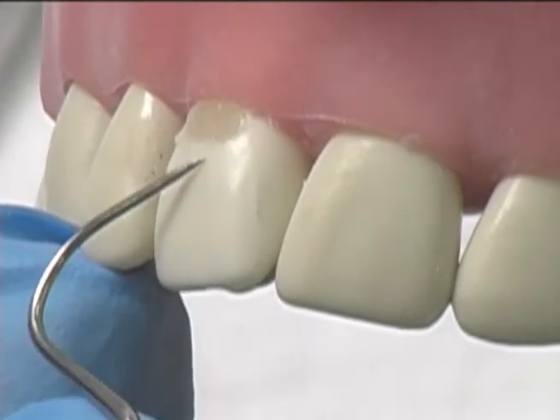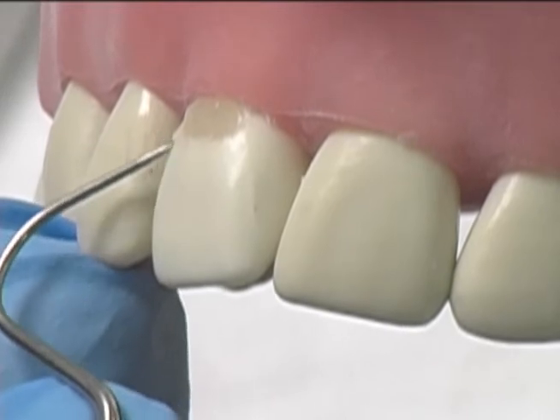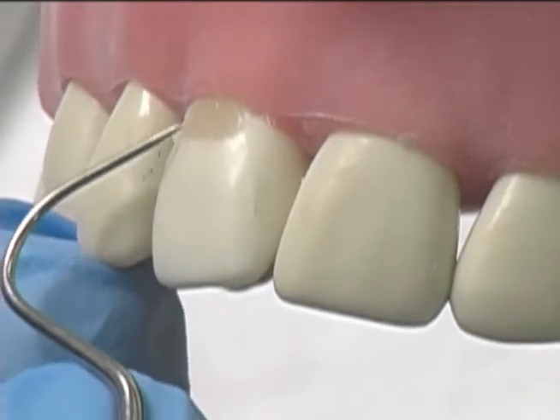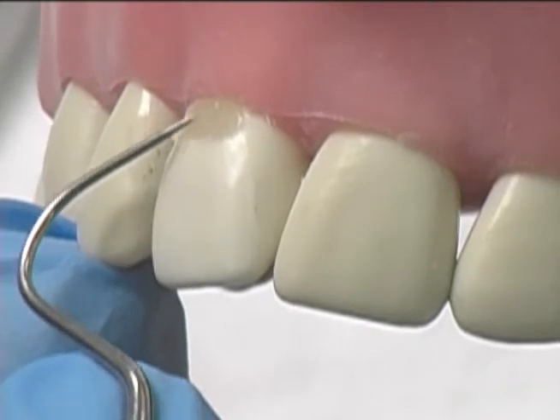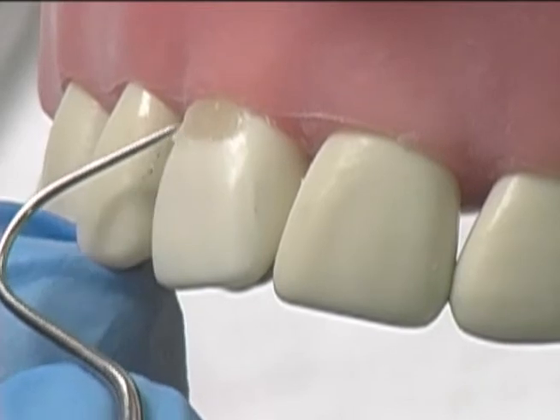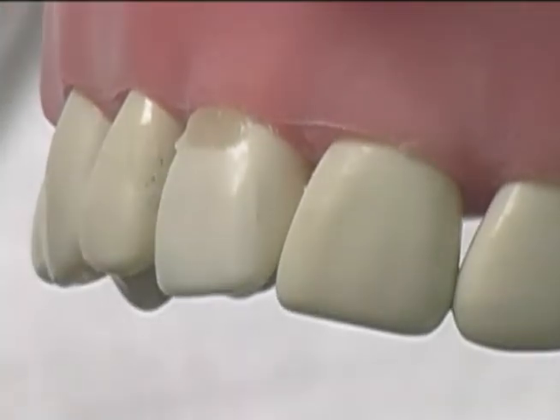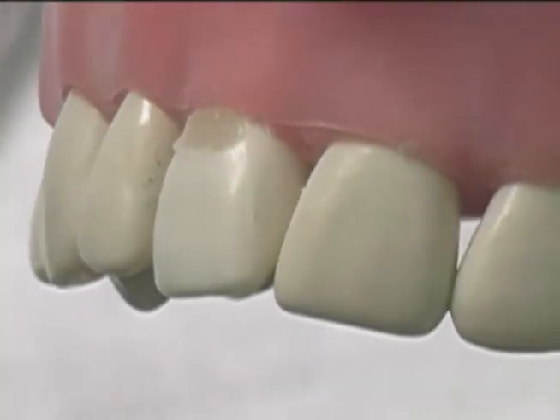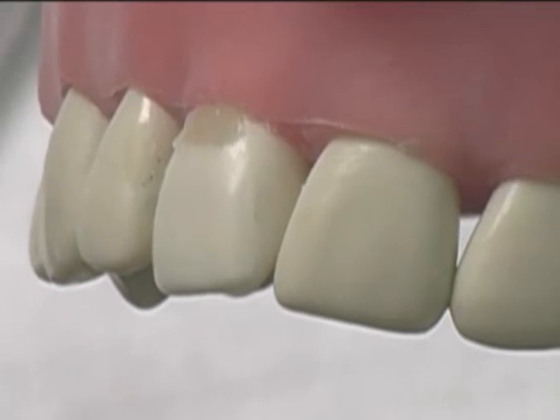It might be better to use something like a white stone to finish this, because as we break these pieces away, a portion might carry away a portion of the filling material. If we're trying to chip it away, we might carry away a portion of the material that actually should be part of the restoration. And so we can use a 12-bladed carbide, for example, and finish the restoration to a smooth contour.